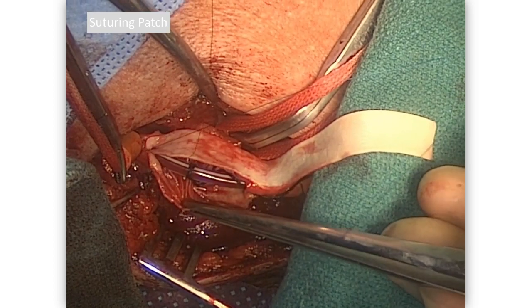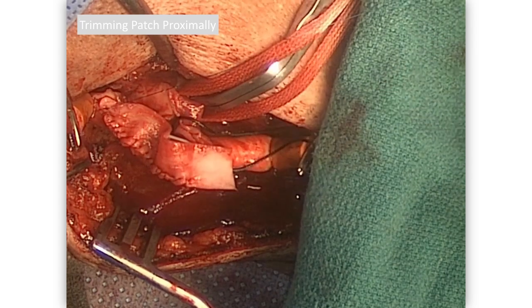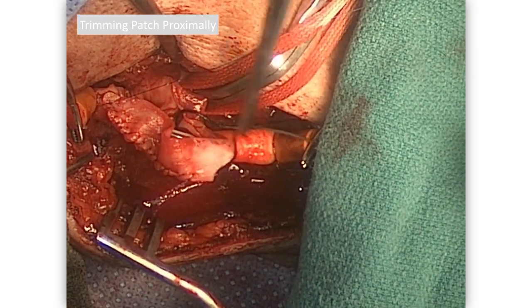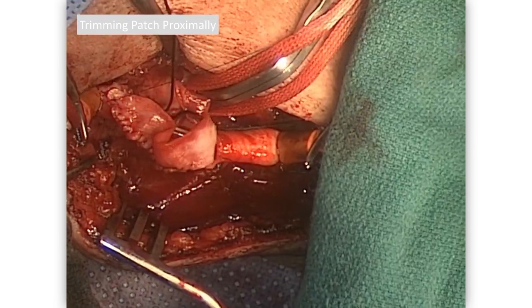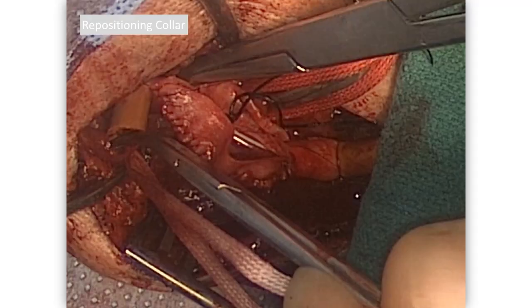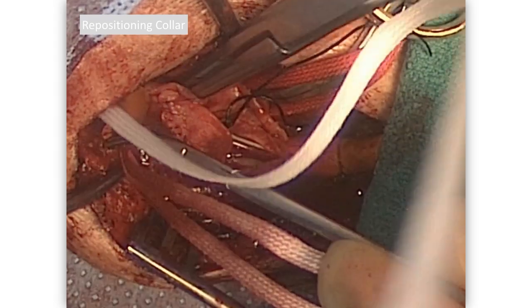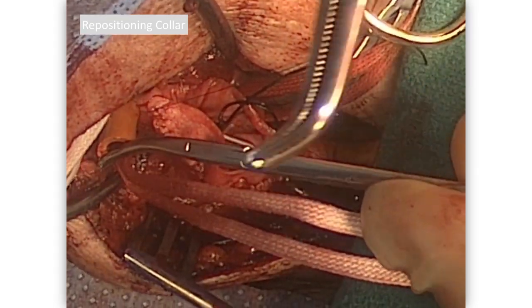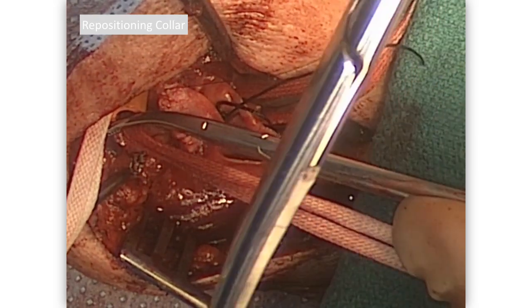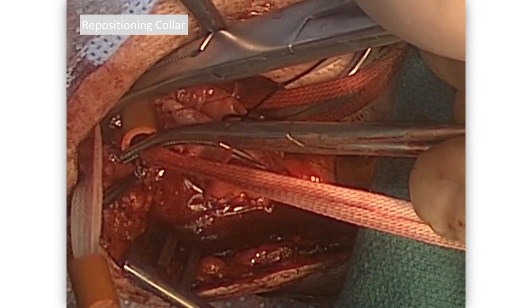Sew all the way up the side of the patch, stretching the patch out. It's important to start looking early to judge the length, because the carotid can be curled up a little around the shunt. Make sure you don't have a size mismatch or length mismatch between the bovine pericardial patch and the carotid artery. Starting to run down the other side — sometimes the collars creep down and encroach, so pass another tape and collar to buy another half centimeter distally. You really don't want bleeding at the apex; it's one of the more difficult areas to see and fix. If in any doubt, move the tape and collar to get the added exposure needed to safely place those apical stitches.